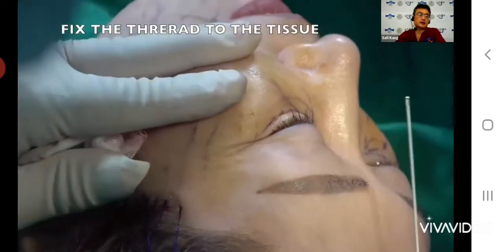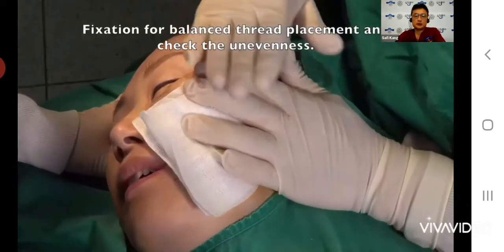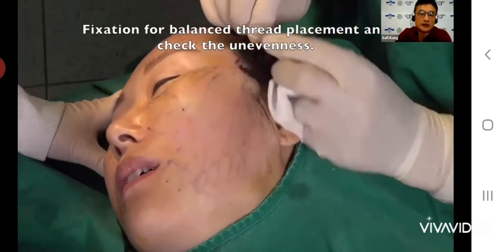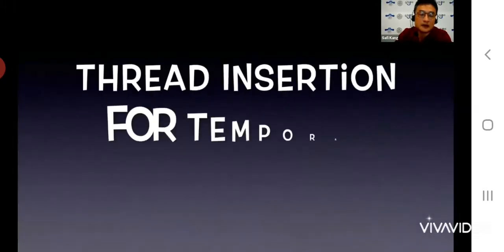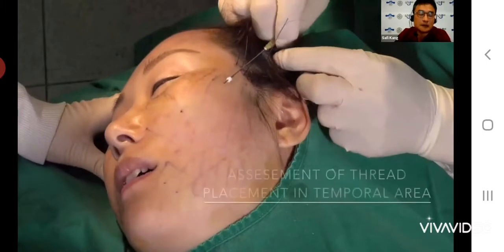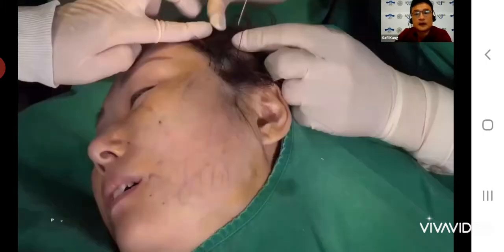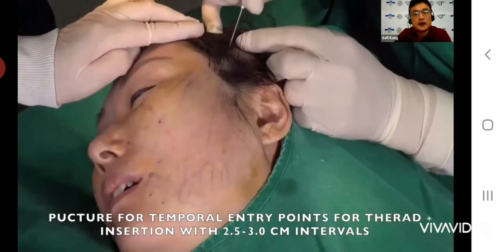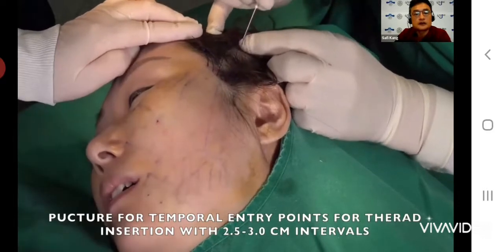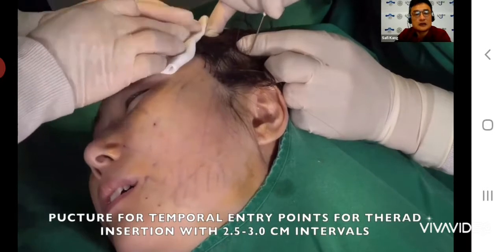So combined together, my target for the low and mid face is to make this plane, not individual thread lifting, but I'm making a plane like this, a whole plane of soft tissue. And then here I'm making the entry site for the temporal lifting. So puncture with an 18 gauge needle, 5 to 6 entry sites are necessary.